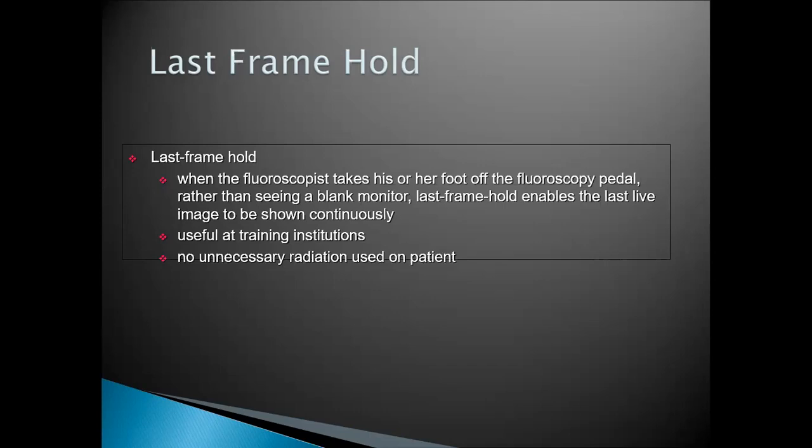For example, the radiologist wants to have a better look at that particular image, maybe while advancing the catheter through the body. Got to a point where the fluoroscopist wants to see the journey of that catheter in a more detailed fashion.